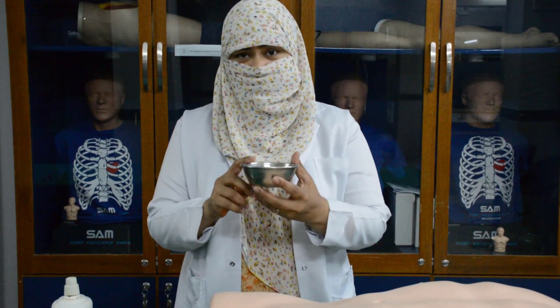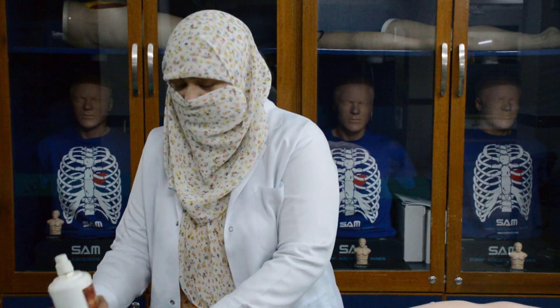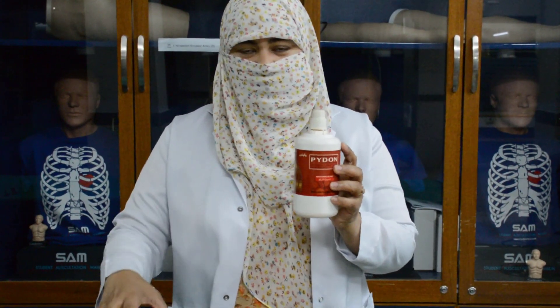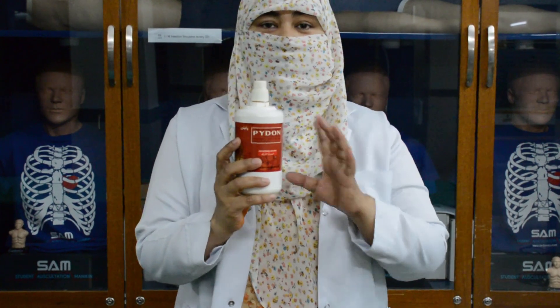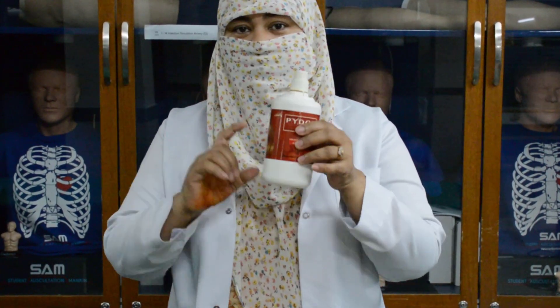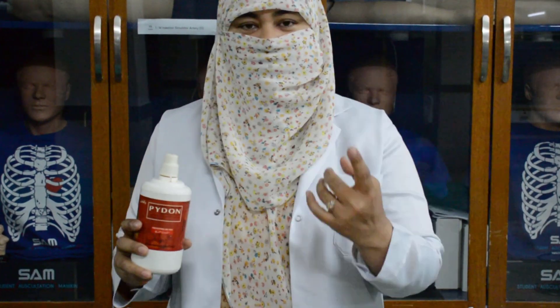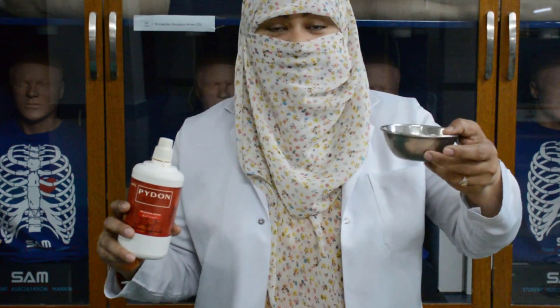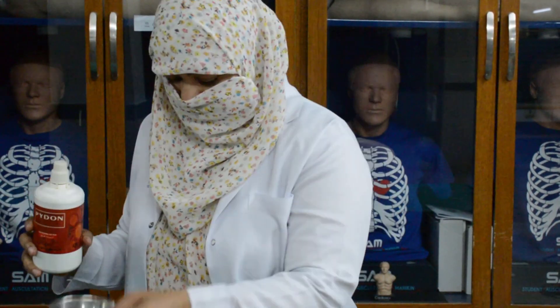This is the gully pot, and in it there will be whatever solution you use to clean the patient. We usually use Povidone solution, which is kept within this gully pot. This bottle you cannot handle while you are already scrubbed — you cannot put it on the sterile trolley. Your assistant will pour Povidone iodine solution into the gully pot, and you can touch the gully pot once you are already scrubbed.